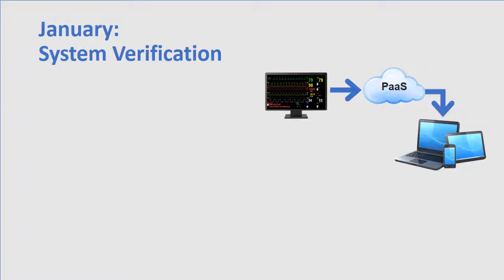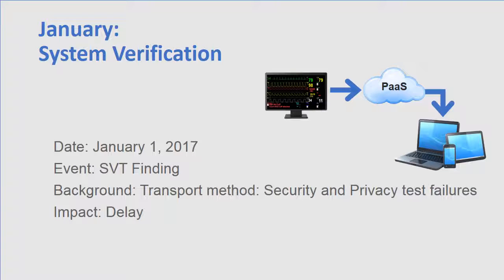The monitoring system is built on a platform as a service, with a focus on medical device systems. Development was therefore quick, and now the system has been released to quality engineering. Two weeks before the expected launch, the quality group delivers some bad news. It turns out the system is vulnerable to packet sniffing between the patient monitor and the cloud.